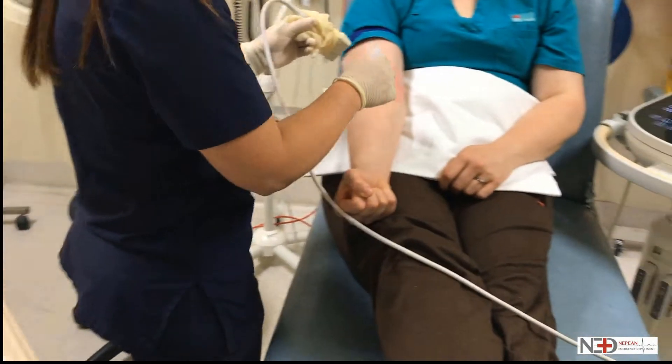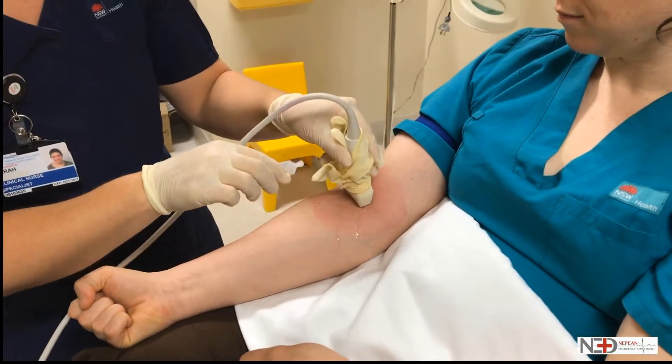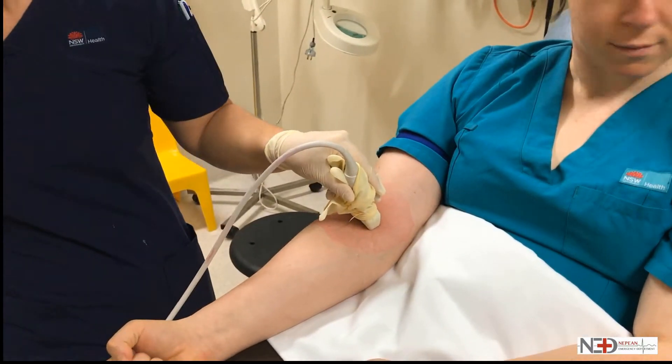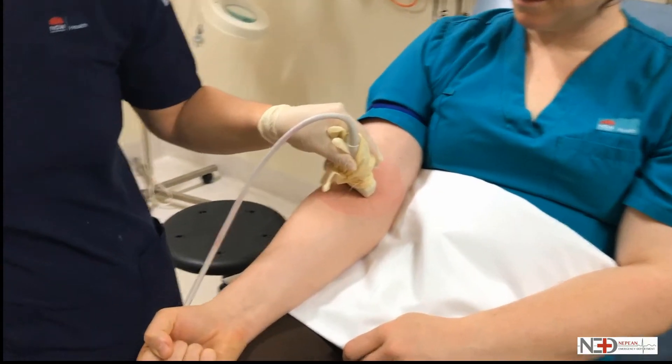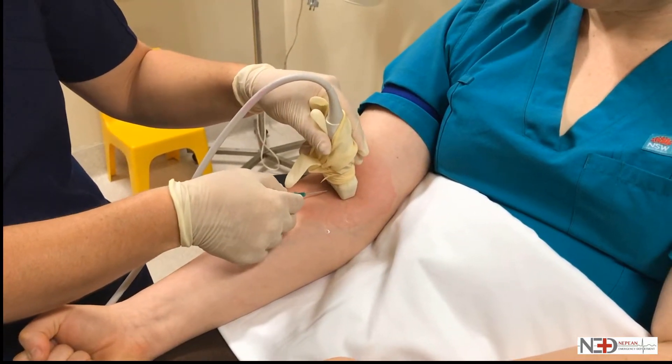For the interface between the probe and disinfected skin you can use sterile gel or even sterile water or chlorhexidine. Here we see sterile water being used. Now let's insert that cannula under ultrasound guidance.